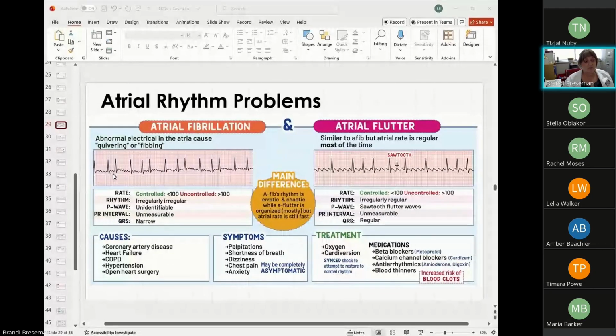And you would give a range for your heart rate. So maybe your widest spacing would put your heart rate at, let's say, 92. But your closest ones would put your heart rate at 125. Well, then you're going to say that your heart rate is 92 to 125.